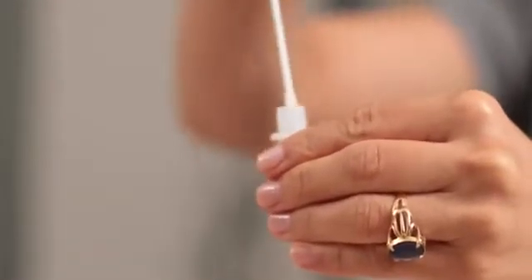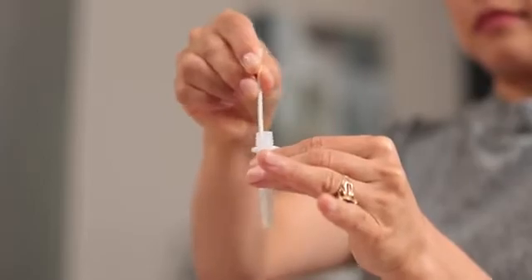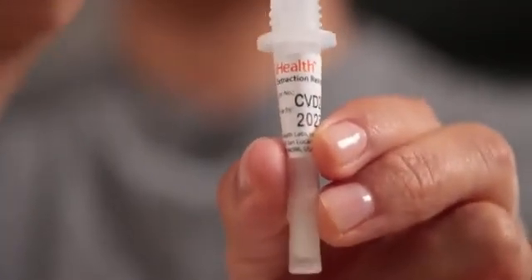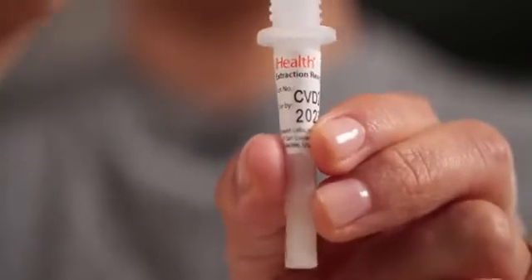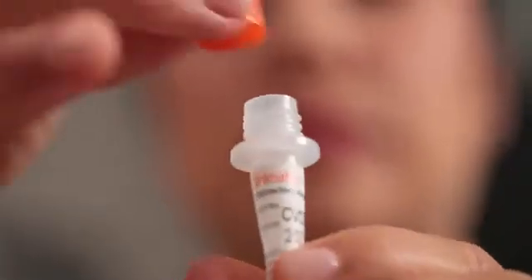After swabbing both nostrils and without letting the swab touch anything else, remove the large lid from your test tube and insert the swab all the way into the solution. Twist it back and forth in the solution at least 15 times. And as you're removing the swab from the tube, squeeze the sides of the tube to wring every last drop of delightful solution and sample out of that swab. Then replace the large lid back onto the tube.